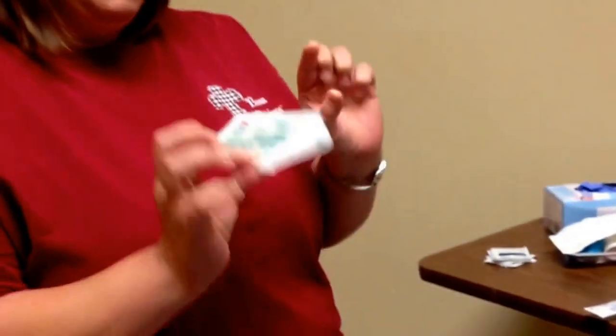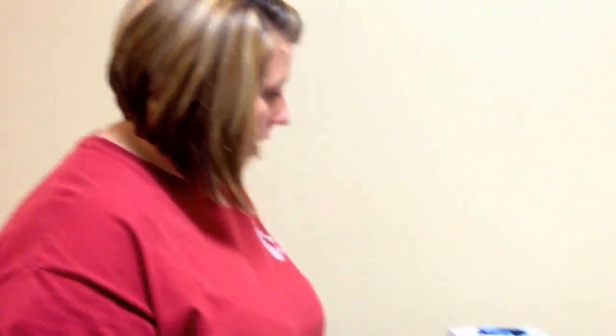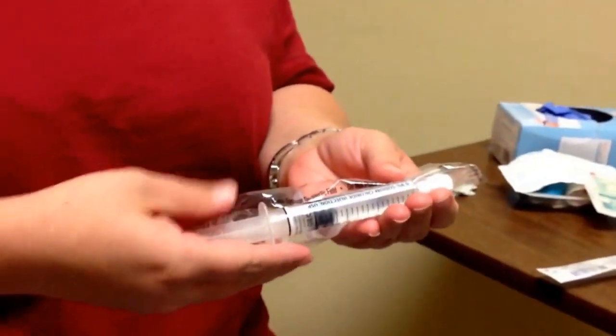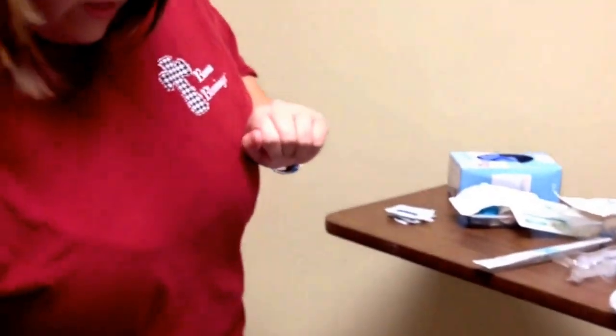I get my catheter line. Generally your Tegaderm is going to be in your IV start kit, but I did get a Tegaderm. I have some extra alcohol preps, my saline flushes, a towel, my gloves, and my MAR if that was applicable. So I have all my supplies.